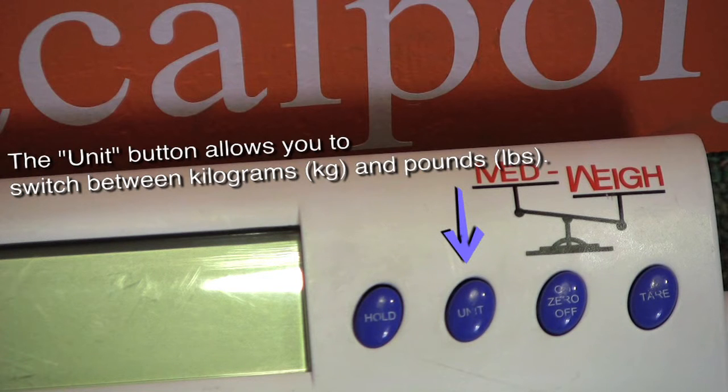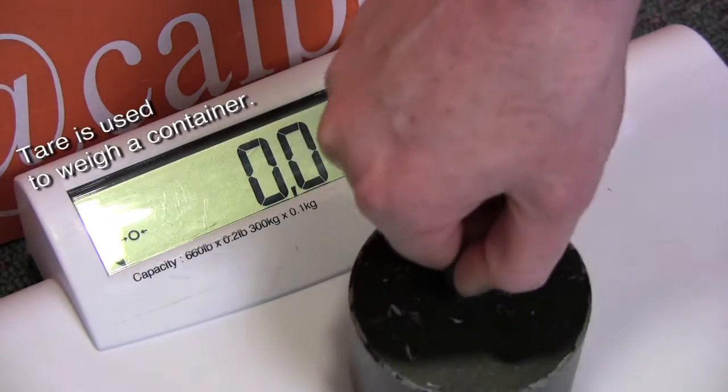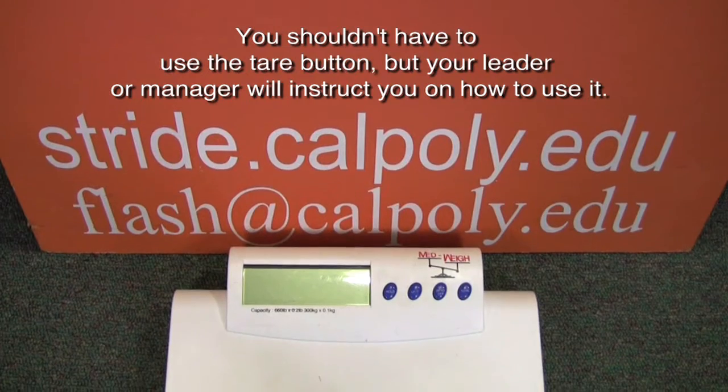The Unit button allows you to switch between kilograms and pounds. The Hold button allows the participant to step off the scale and have the number displayed. Tare is used to weigh a container. You shouldn't have to use the Tare button, but your leader or manager will instruct you on how to use it.